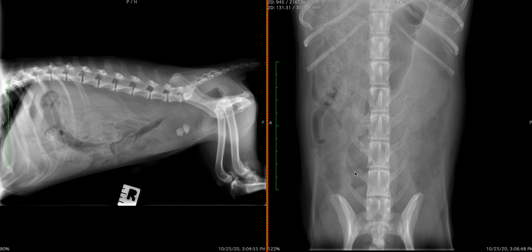Radiographs have started the diagnostic journey for this patient. However, more information is required. From an imaging perspective, next steps can include abdominal ultrasound, intravenous excretory urogram, or abdominal CT with a protocol adapted to an excretory urogram. Be sure to view the full report associated with this case.